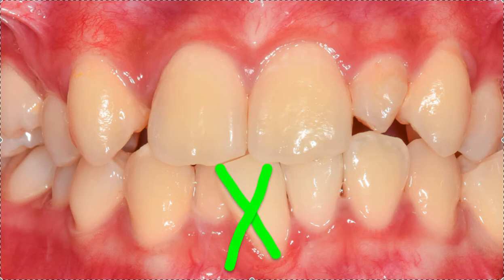So when do I do lower incisor extractions? Well, when the patient's a little bit class 3, or when the patient is a perio patient with a lot of lower incisor crowding, and we do not want to flare those teeth forwards. Sometimes in a case like this, it's much healthier, easier and faster to go ahead and take out a tooth.